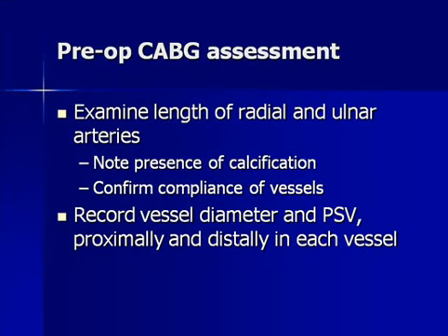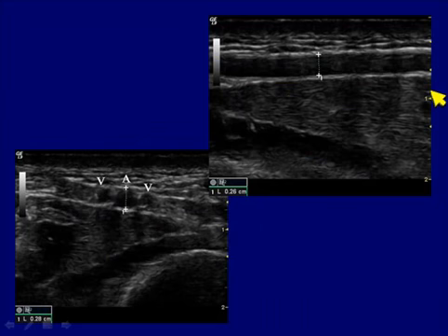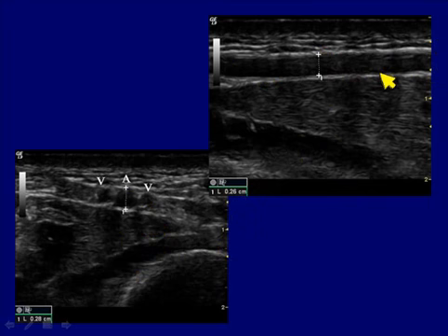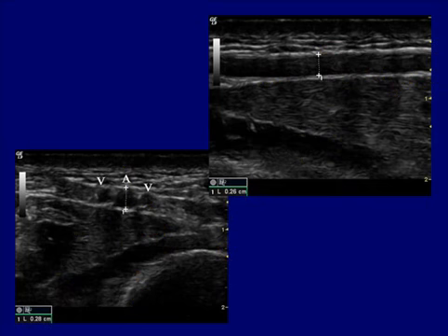We evaluate radial and ulnar arteries for patients undergoing coronary artery bypass — to ensure they're adequate, look for calcification, confirm compliance, and record diameter and velocities. For measuring diameter, it's probably best to use a transverse view to confirm we're not oblique to the artery. In this example, the vessel measured sagittally was 2.6 mm versus 2.8 mm transverse — that matters if somebody is borderline, as we want to avoid disadvantaging them.